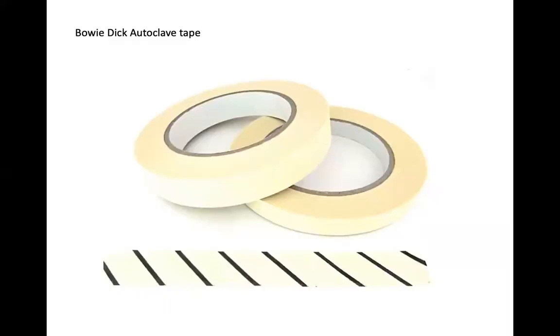And before I talk about biological, let me just show you an example. This is an external QC. It's a Bowie Dick tape. It's an autoclave tape.